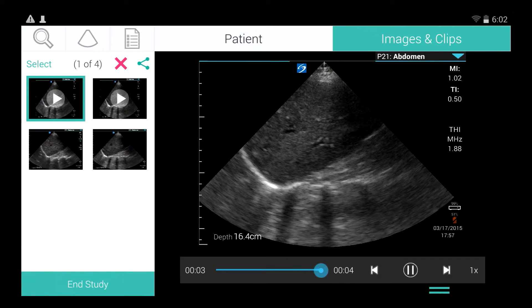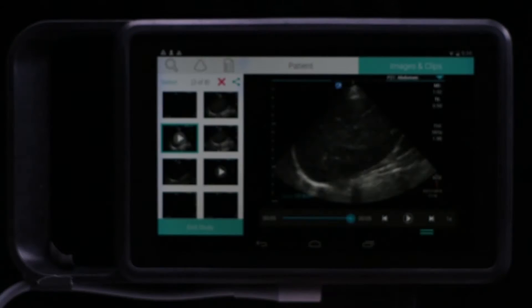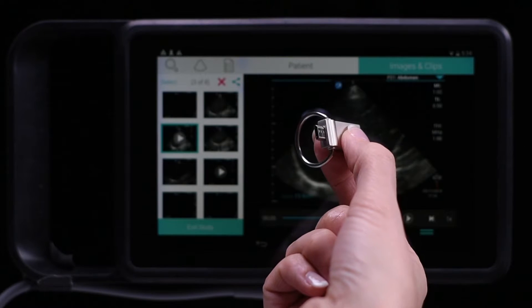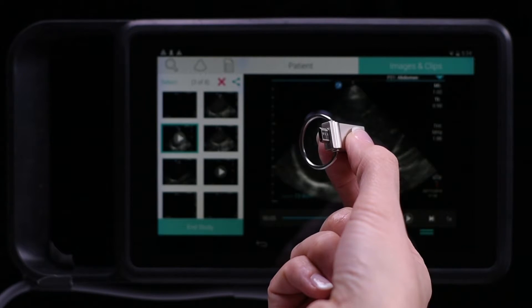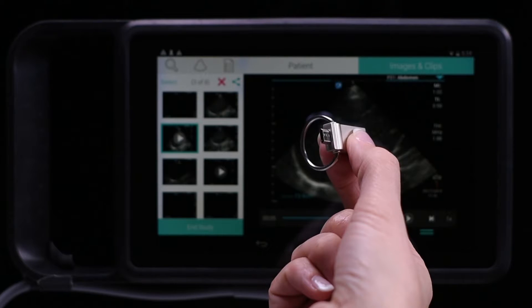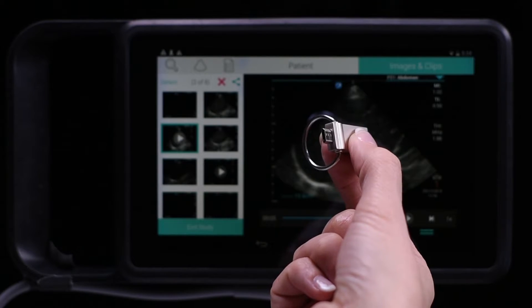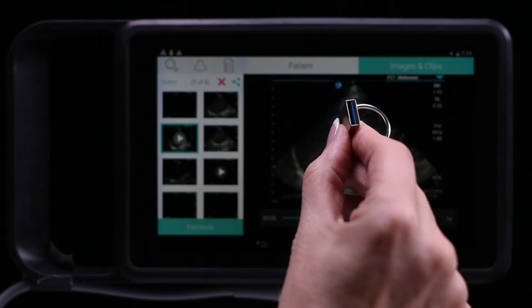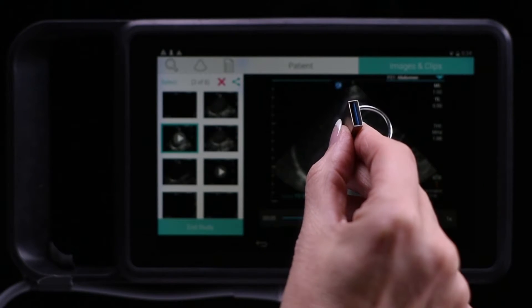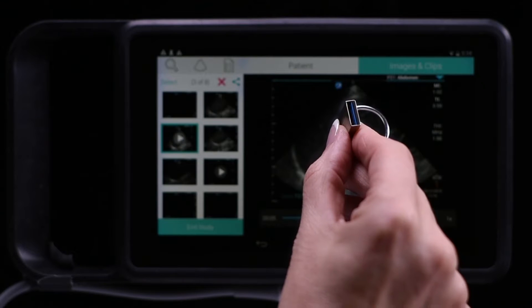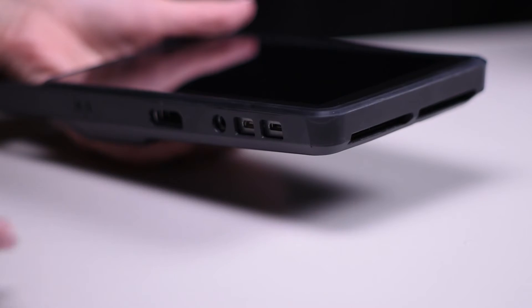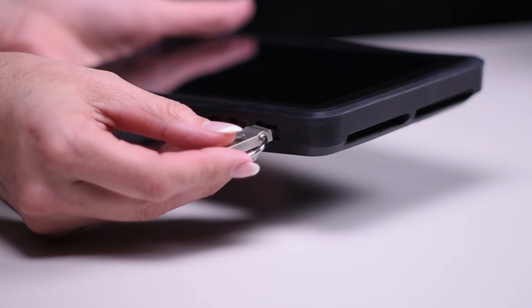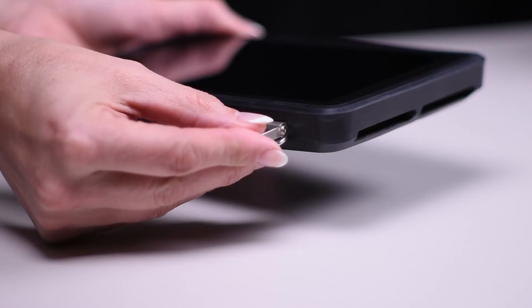The 64 gigabyte 2-in-1 USB drive that comes with your system has a micro USB connector on one end and a standard USB connector on the other. Plug the micro USB connector into the port on your iViz system.